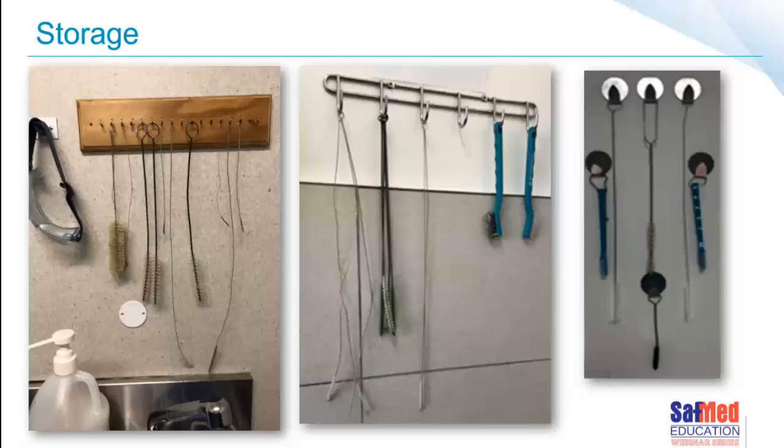So looking at our images over here, this is some good progress in terms of how to store brushes. Looking at the image on the left, I'm not dead comfortable with that one. I don't like the idea that the hanging device, which appears to be homemade, was made out of wood. Wood is definitely not a feature we want on our walls in our CSSDs. And then we've got somebody's eye protection quite close to the brush, and I think that we could contaminate here. There could be some situations for cross-contamination.